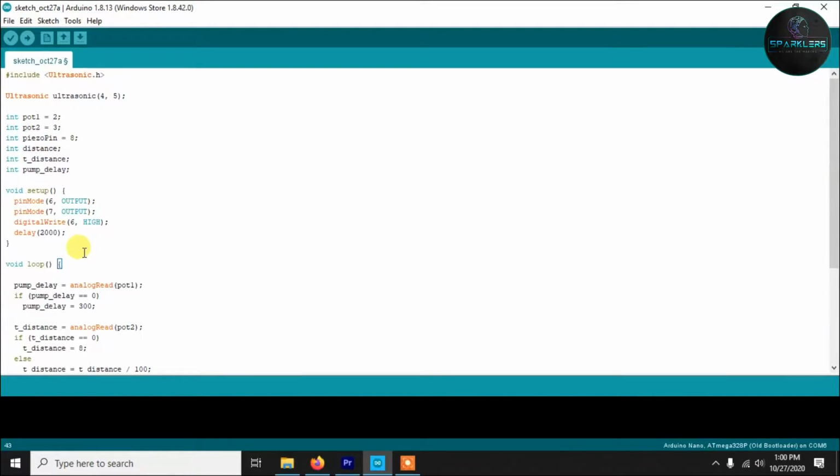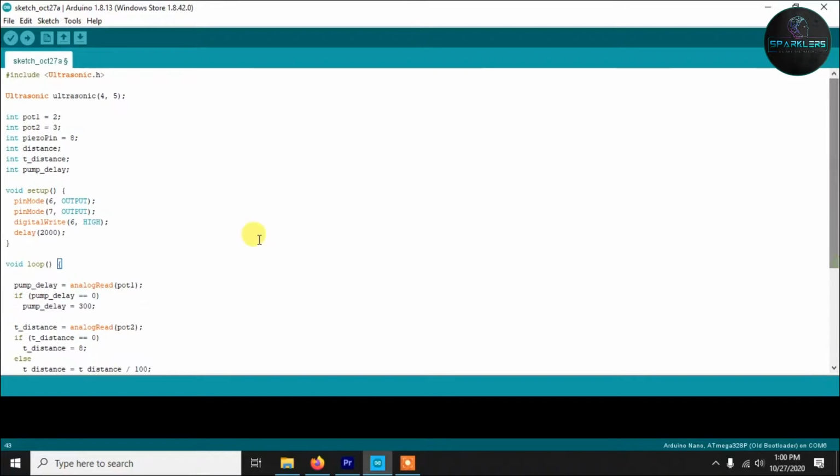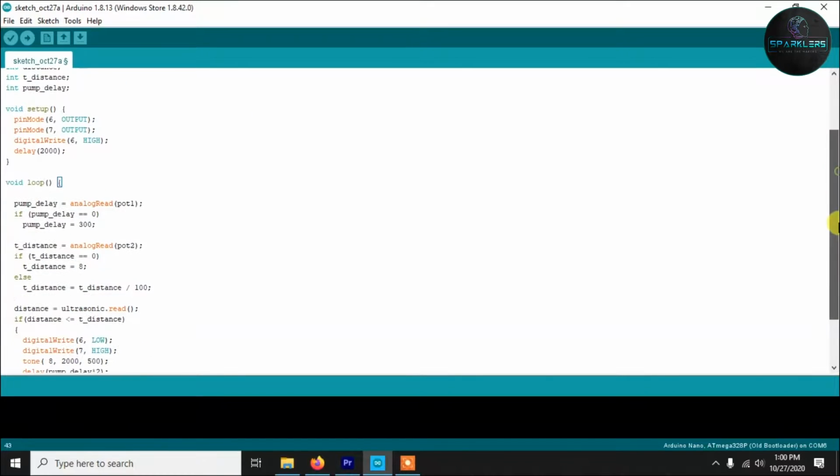Now in the setup I have just set 2 pins as output, pin number 6 and pin number 7. Pin number 6 is for the relay, which will turn on the pump, and pin number 7 is for the LED. So you need to initialize them as output. We don't need to do it for the piezo pin because we are going to use a library for the piezo pin, and yeah, that's it. And we also don't need to initialize the pins for the ultrasonic sensor because the library will do the job for us.